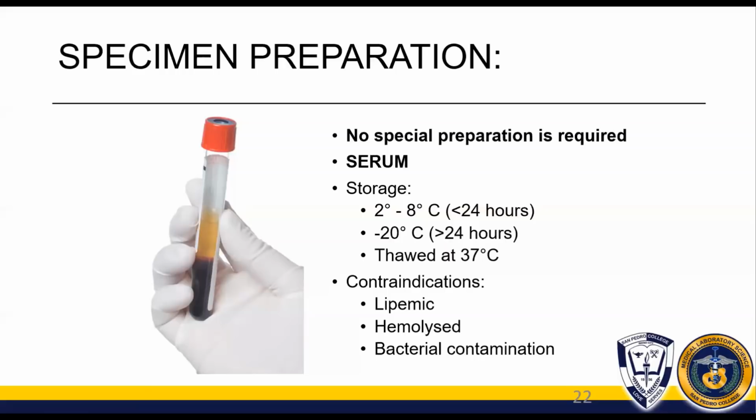Class, serum is expected to have a clear appearance, like in this picture here. But if you notice it is milky, turbid, whitish, probably that is lipemic. So, you cannot process the sample if it is lipemic.